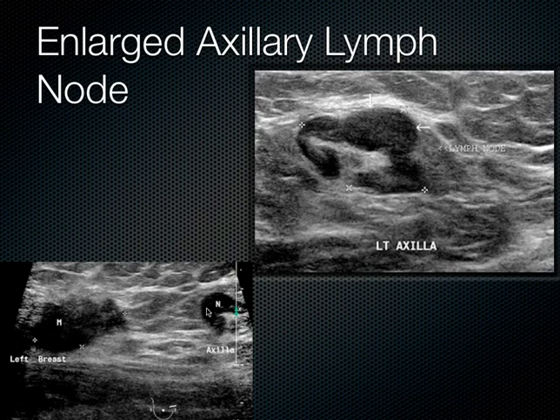And the same thing's going on over here. Here's the malignancy over here growing in the breast, and on the same view, if you stretch the probe out across and have one edge of the probe over in the axilla, you can see the enlarged lymph node in the same patient. So you see both the breast cancer and the lymph node if they're close enough together and you turn the probe that direction.